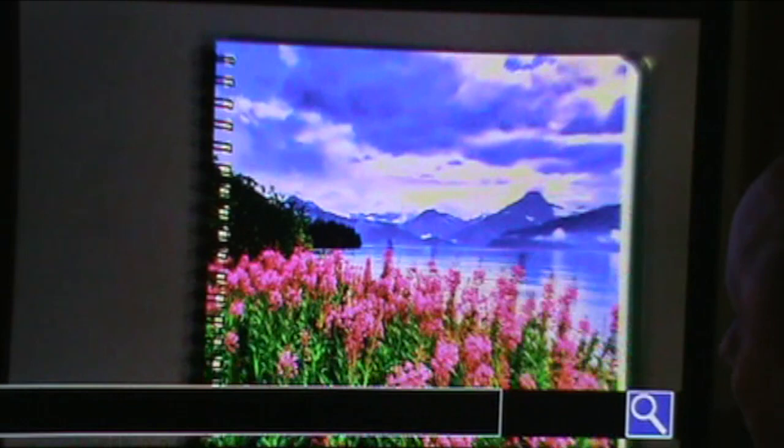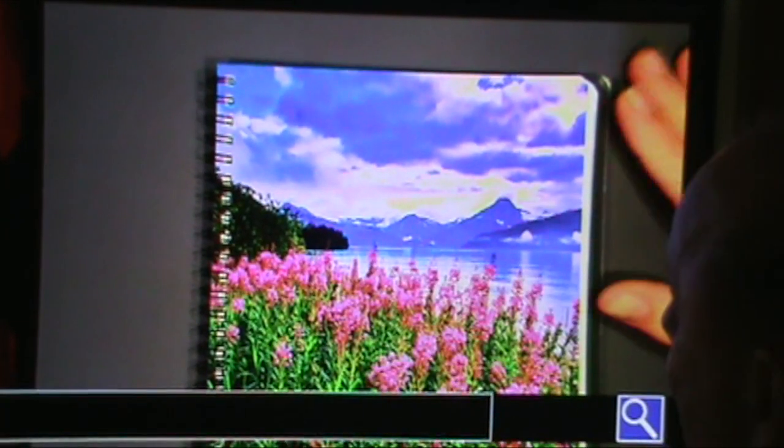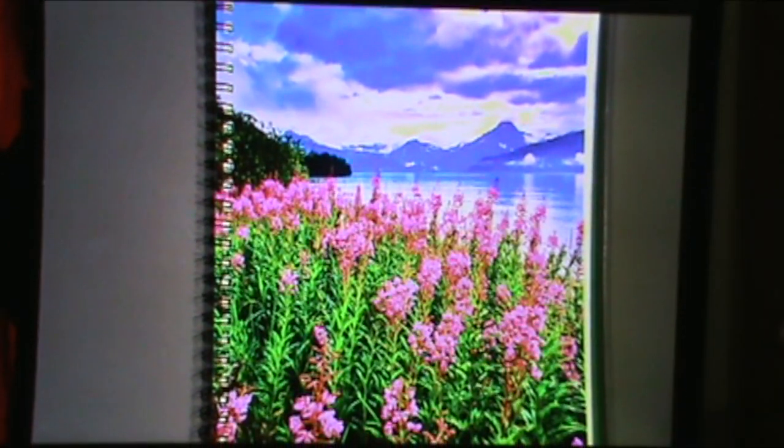And we're going to go ahead and magnify so much that we are now, believe it or not, looking at the dot pattern of the page. This is a dot matrix page, and you can kind of see how the colors are being put onto the paper here with the ink. So that is actually quite interesting, that we can actually see quite in on this. So this system has a very, very good magnification range. Very good vibrant color replication.